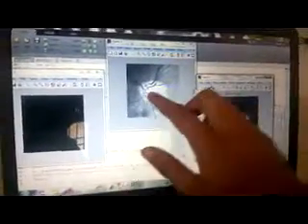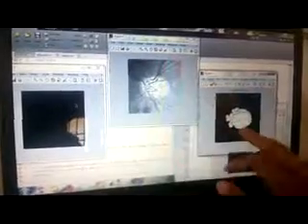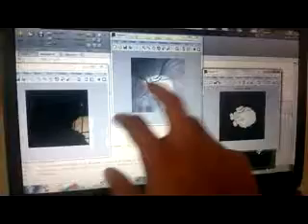As we said, we generated a dark image to compare with the black and white image and the disc image. By comparing these two images, if the pixel value is greater than 230, we keep that pixel by multiplying these two images.